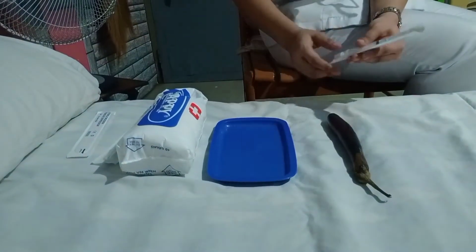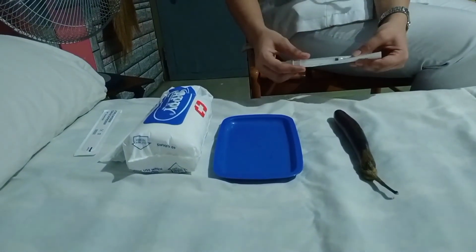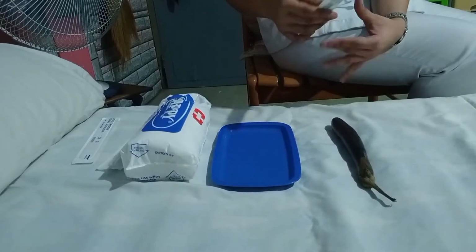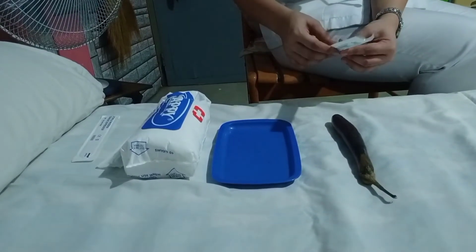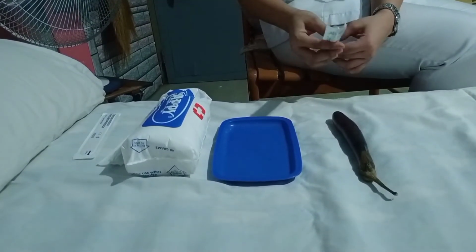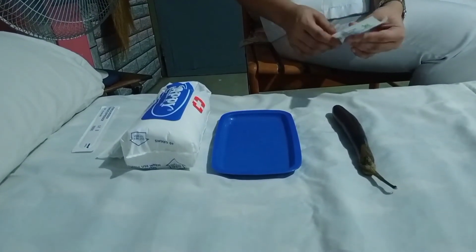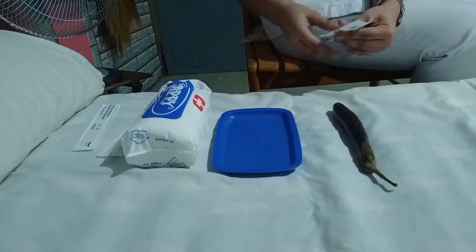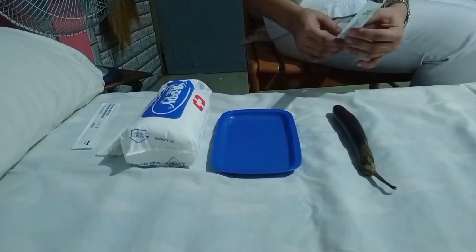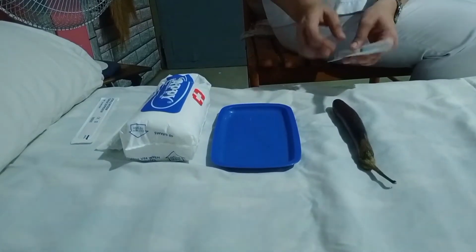The rationale for this is that pharmaceutical products for parenteral administration are supplied in various containers. Next, follow the correct procedure of removing a drug from an ampule or vial. Since we are in quarantine right now, I couldn't buy an ampule, so I will just use water as an example of a medication. The rationale is that the aspirating needle could be accidentally inserted beyond the skin when the intradermal injection is being performed.